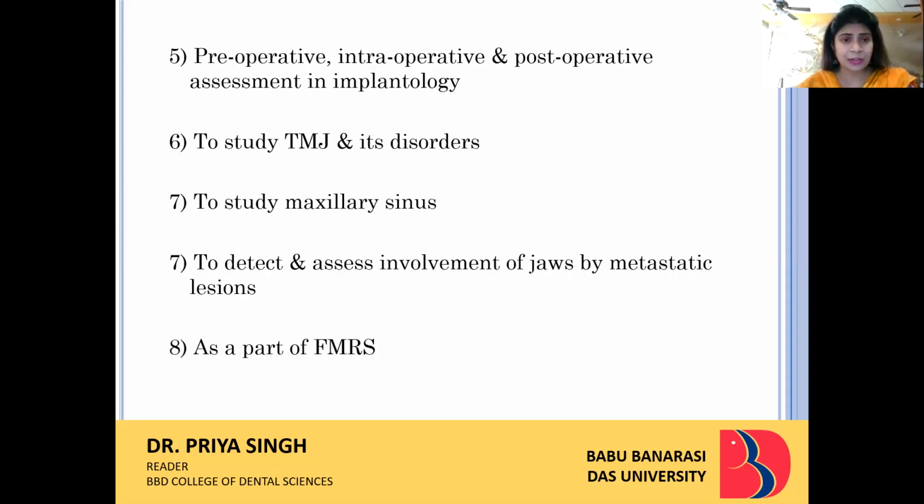It's an important screening radiograph when you want to see the temporomandibular joint and its disorder. If you know what kind of disorder it is, you can further advise the individual TMJ views, which can be transcranial, transpharyngeal, or transorbital. Then to study the maxillary sinus, since it's not only showing your arches, it even shows you the maxillary sinus. Very important aspect at times, as pathology of the sinus might lead to a feeling of pathology in the maxillary teeth. So to study the maxillary sinus also, it will be very beneficial.